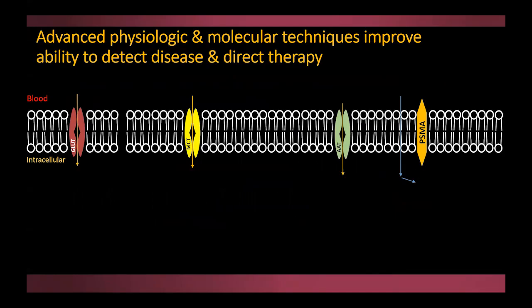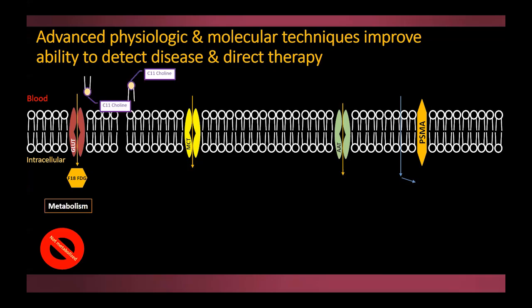So let's go over the concept of functional images. We do know that we have the most commonly used in oncology images, F18 FDG. It's a sugar base. It goes through the cell via GLUT transporters, and it will mimic metabolism, but it will not be metabolized. It will also be trapped within the cell once it goes in. Now, when it comes to prostate cancer, we don't commonly use it because the upregulation of GLUT transporters in prostate cancer is variant between different histology, from differentiated to poorly differentiated.